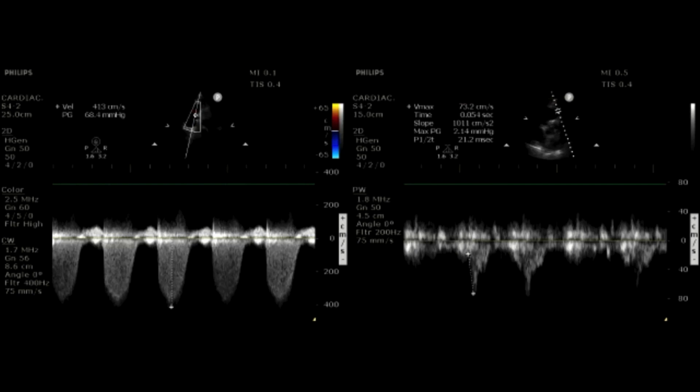Do you think, based on your experience, that if we saw something that fit this mold, right? They fit the 60-60 sign, they're hemodynamically crashing, would that be enough for you to pull the trigger and say, okay, I either need to give TPA or call my interventionalist to give IA or do a thrombectomy?